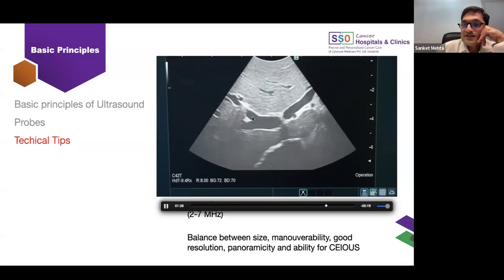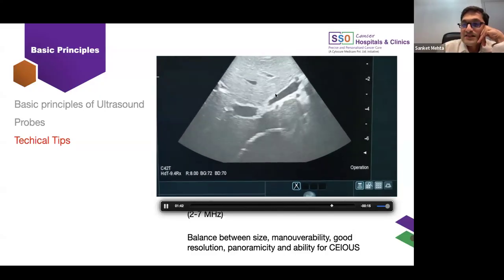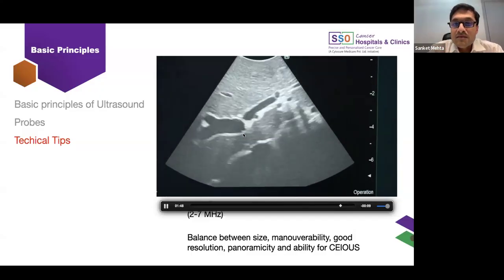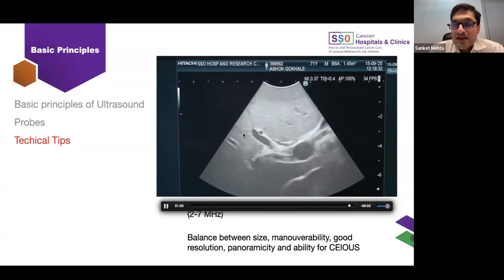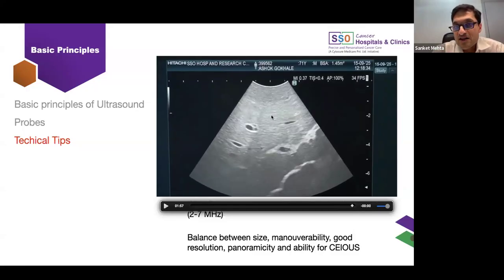And that's the confluence once again. You can very well delineate the Laennec capsule. This is the structure that helps us perform the R1 vascular resections, where we can peel off the tumor without increasing the risk of local recurrence, because it's a tough layer that helps us do the dissection.